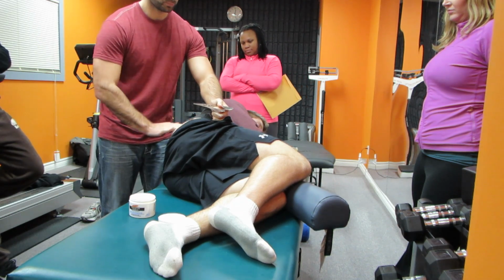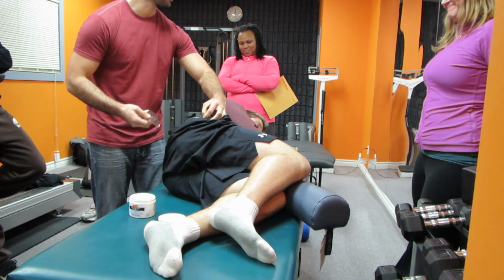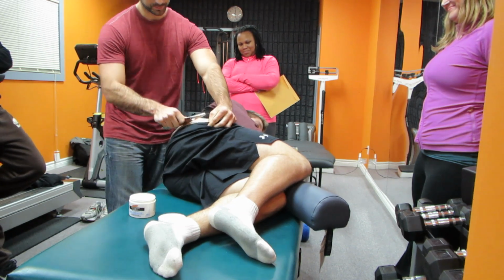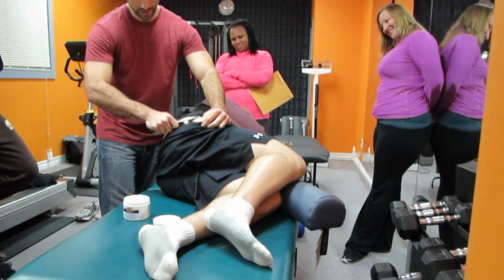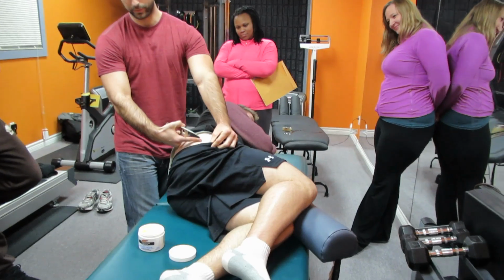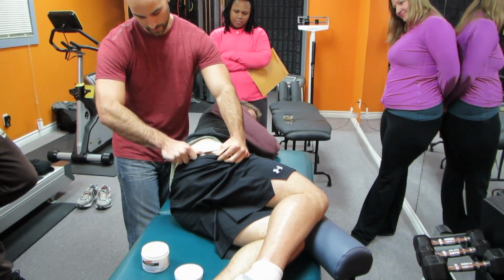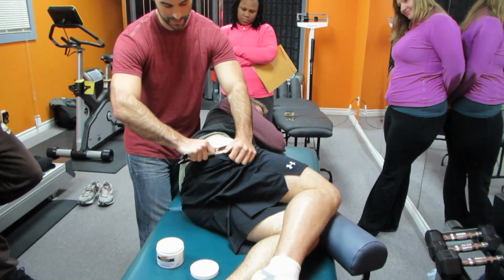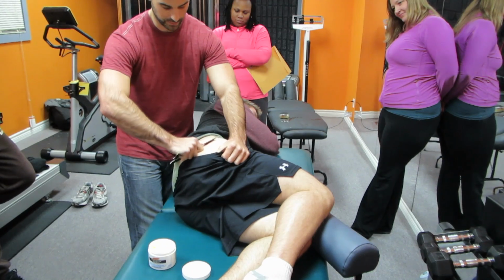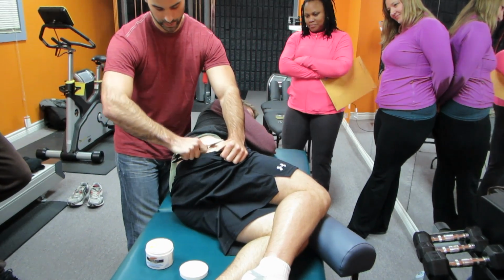If you guys want to get more personal with each other, you can go a little bit further down too, but for the demo, we'll just stay a little bit higher, okay? We're going to start in, and I like to follow the glute around this way, so we can see. And in everybody, through the glutes, we're going to have a lot of dysfunction, okay? I'm starting off with treatment point number 2 there.